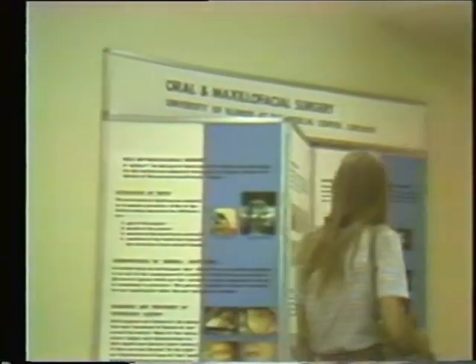This part of the orientation to the oral and maxillofacial surgery clinic will cover your treatment of patients. We'll describe history taking, chart review, case presentation, aseptic techniques, and postoperative instructions.